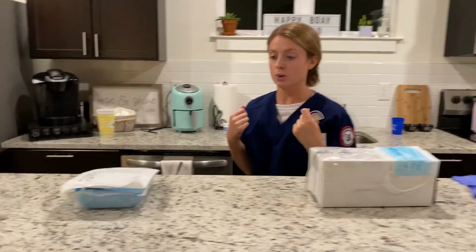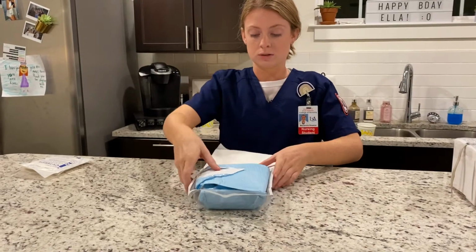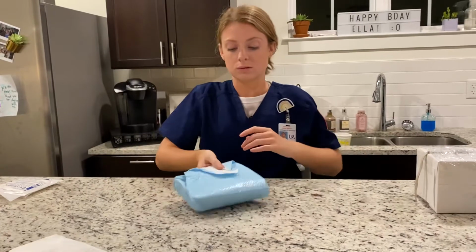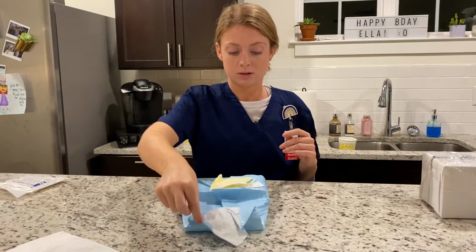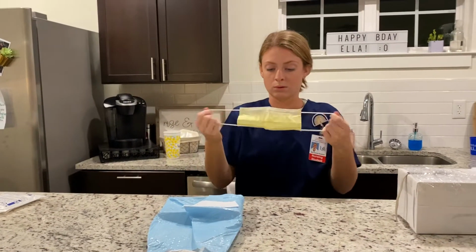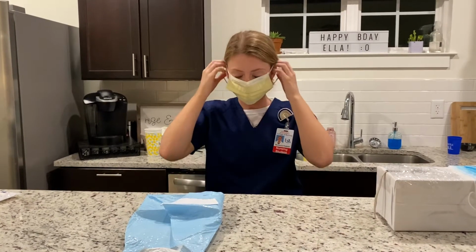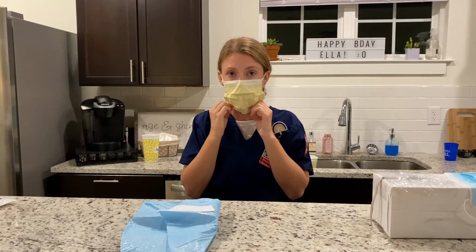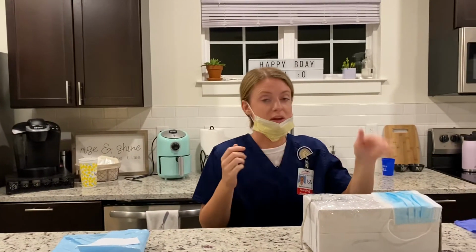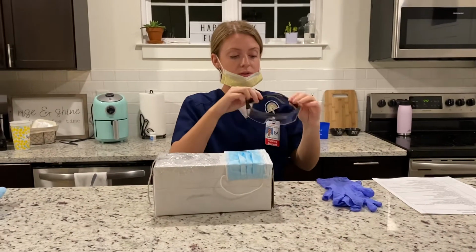So now I'm going to open up the kit and get the mask out. So I'm going to put this mask on, but for the purpose of the video, I'm going to pull it down. And then I'm also going to make sure that the patient has a mask on also. And now I'm going to put my goggles and my gloves on.